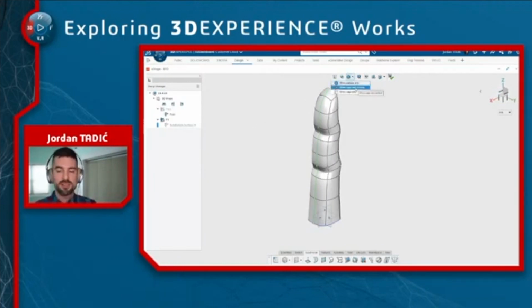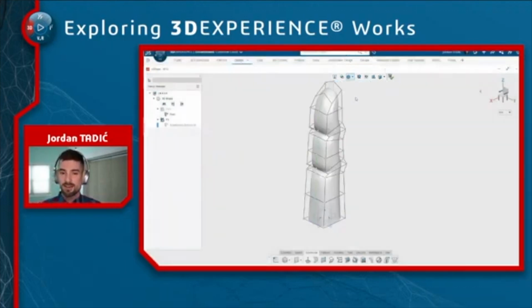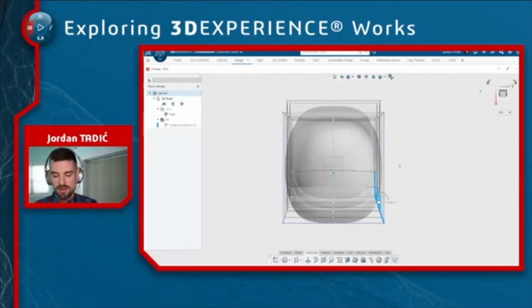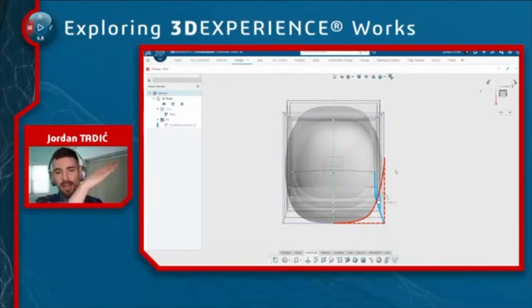So what I'm going to do is show what's called the cage surrounding this geometry. Anytime I want to get a better understanding of why the surface looks like it does, I show the cage, because it's exposing the underlying math behind the shape of the 3D model. Now, if you've ever sketched a spline in SolidWorks, you'll understand this pretty well, because the new style spline that we added a handful of years ago is the absolute easiest and most efficient and highest quality way to sketch a spline in SolidWorks, because you're doing it with construction lines and it's best fitting a spline through those. Makes it easy to parametrically define with dimensions and sketch relations.